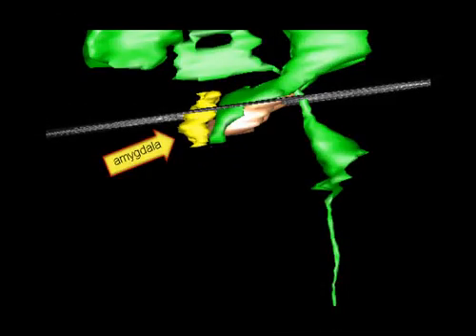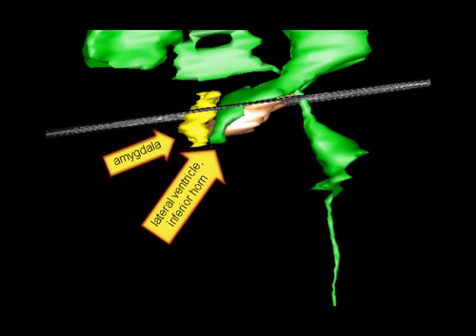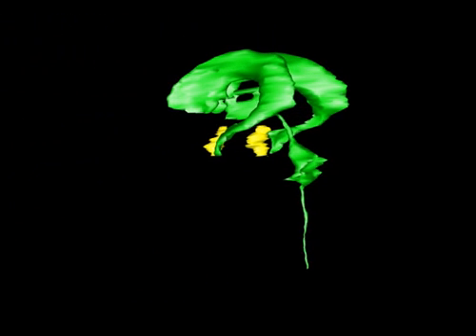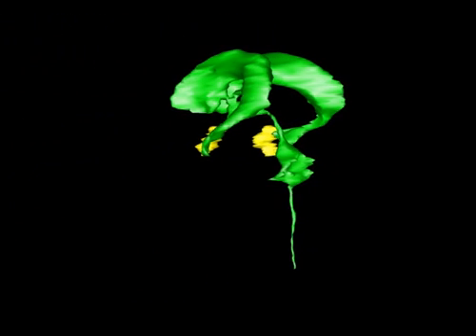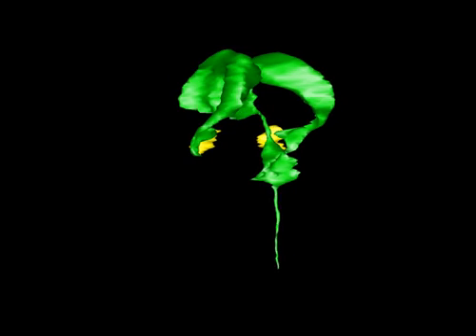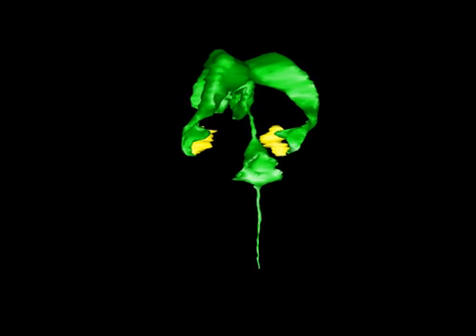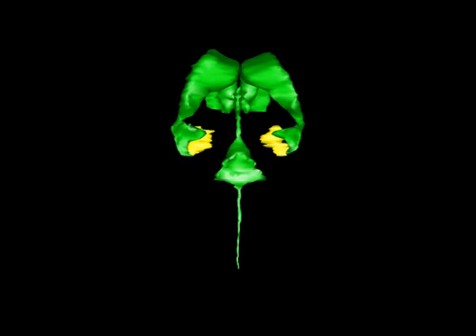We end this movie with a 360-degree rotation of the 3D reconstructed amygdala together with the lateral ventricle. Note the relationship of the amygdala at the tip of the inferior horn of the ventricle.